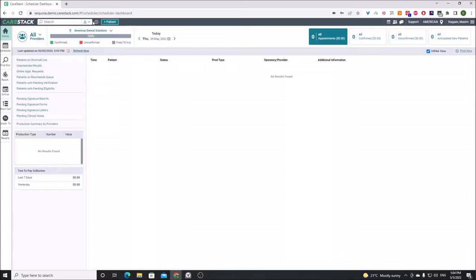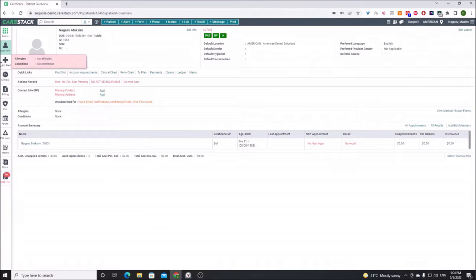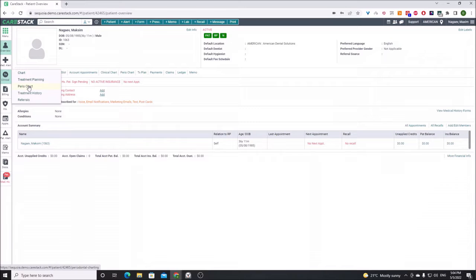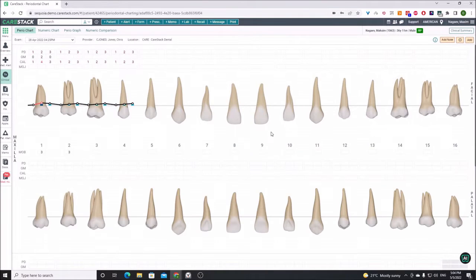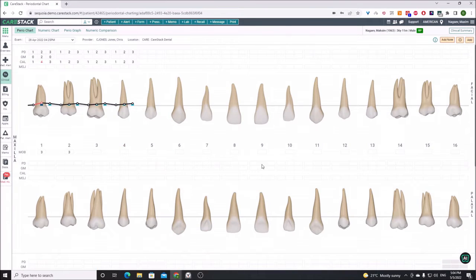Today we're going to see the interaction between Denti AI and the Kerastack Perio chart. We just implemented it at Dr. Dykstra's first office, the Hudsonville location of Michigan Smiles. They've been using it very successfully — they've done about 50 or 60 Perio charts already since implementation and it's going very well for them.